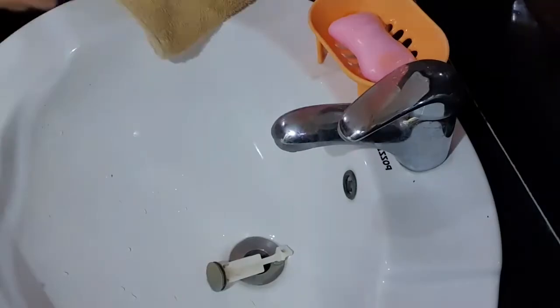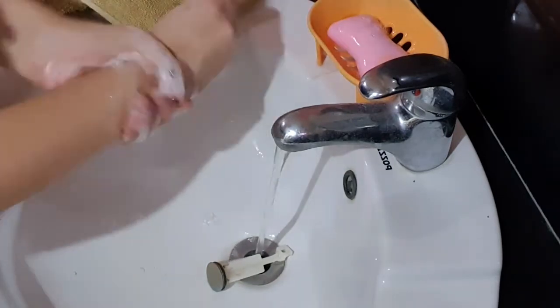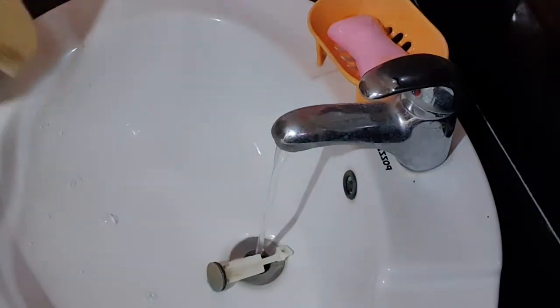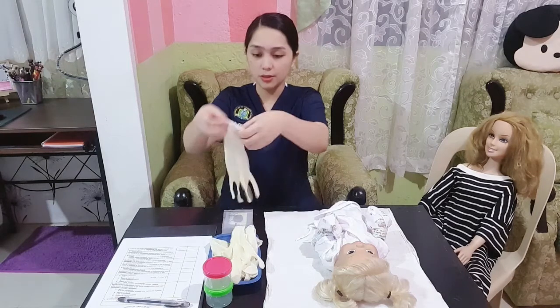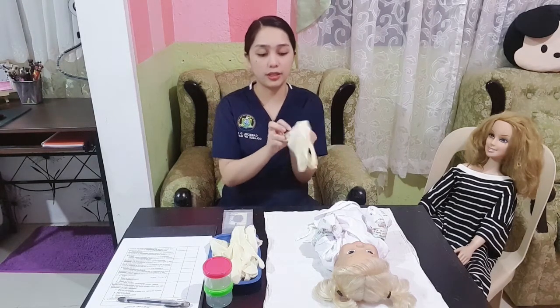Then I will now perform hand hygiene, and apply clean gloves. This reduces transmission of microorganisms.